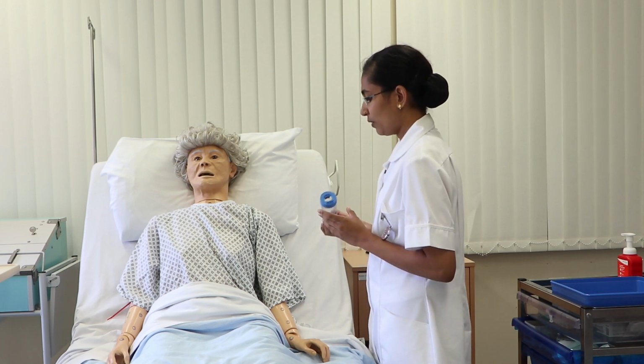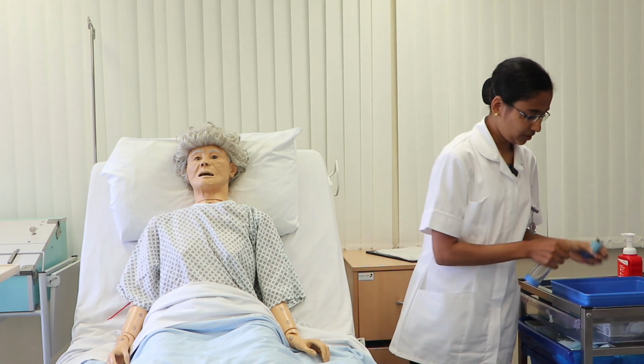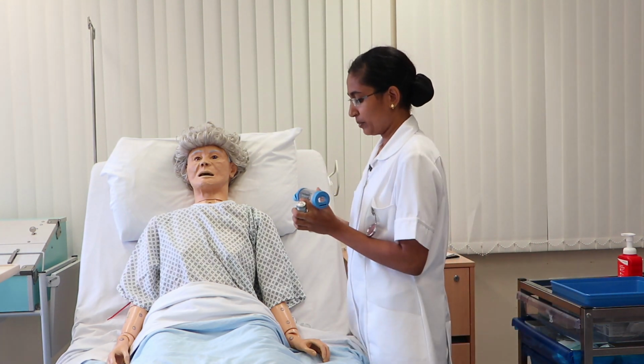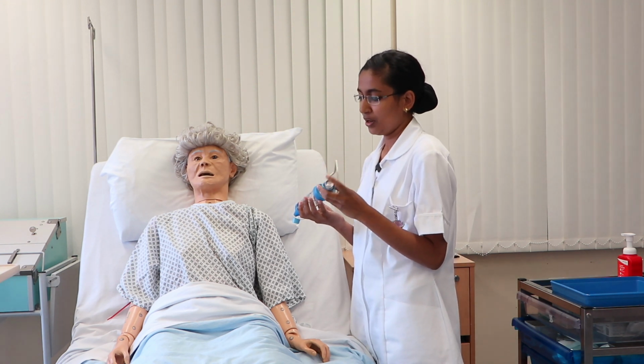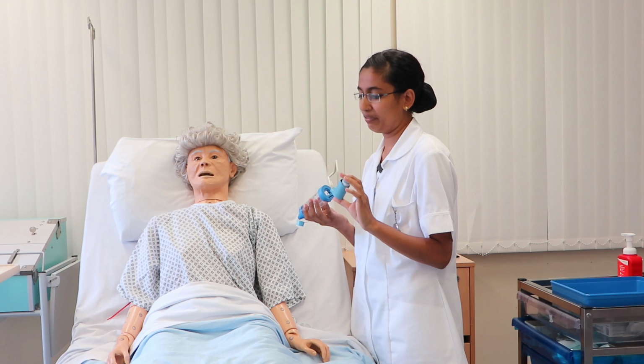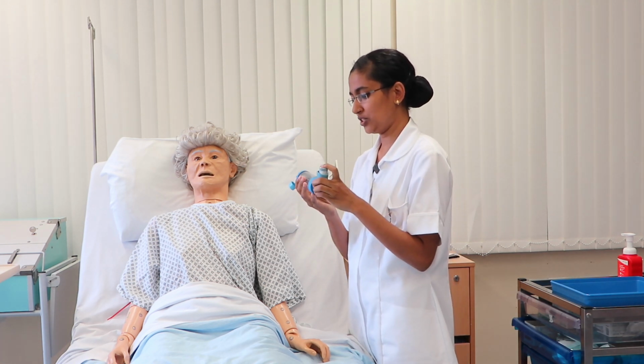Okay. So now I will take the medications for you. I will take off the cap and open the mouthpiece for my patient, and I have to shake the medication for 2 to 5 seconds. 1, 2, and I will connect it with the chamber.